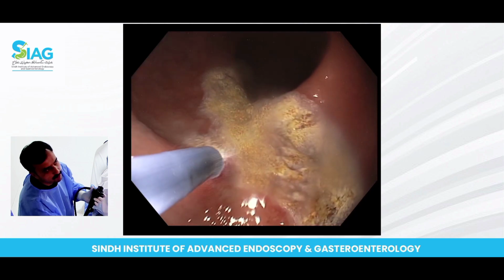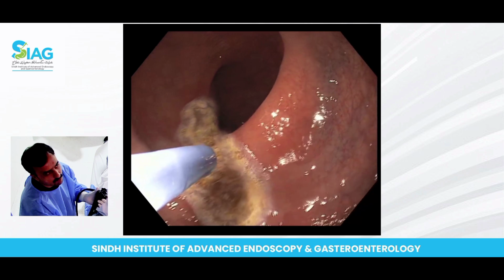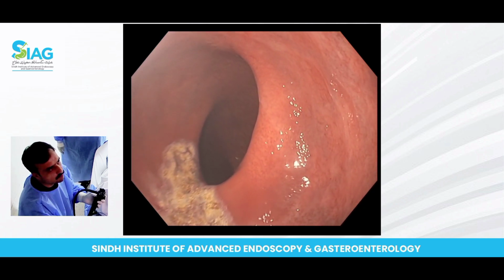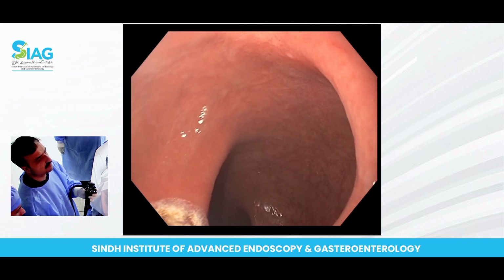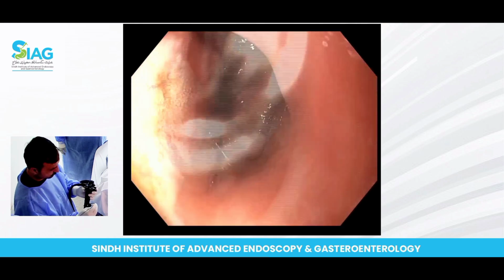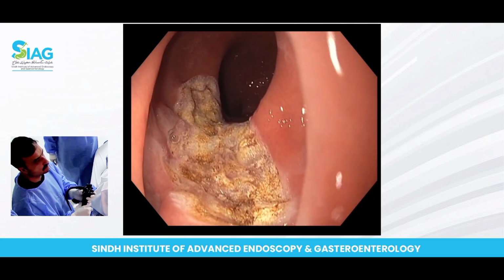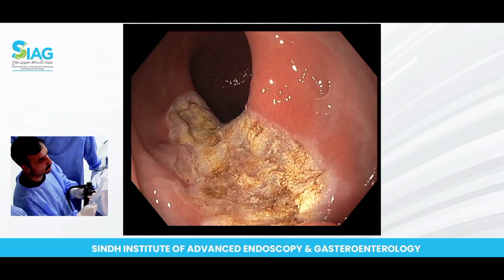Another thing to keep in mind, especially for students who might not be doing this at their centers, is that it is very safe and very effective for these patients. The only thing to keep in mind is that while doing APC there might be some air insufflation; this argon gas can cause distension of the colon, and the patient might feel some discomfort. That's why I have removed this and tried to suck all the air and gas that was insufflated inside. We try to deflate the gas intermittently in between, so that through suction the argon gas we inserted can be removed.